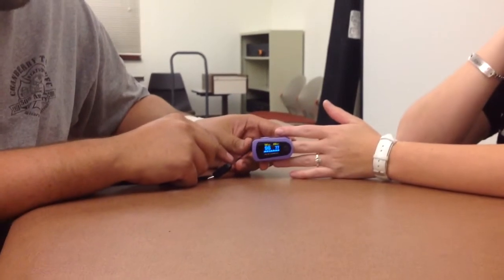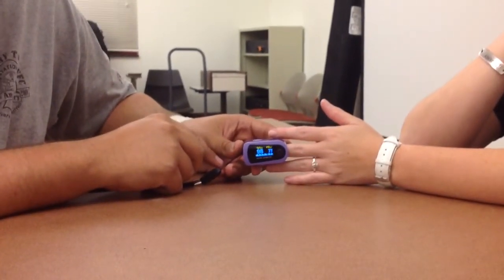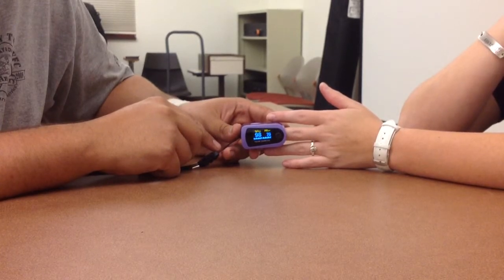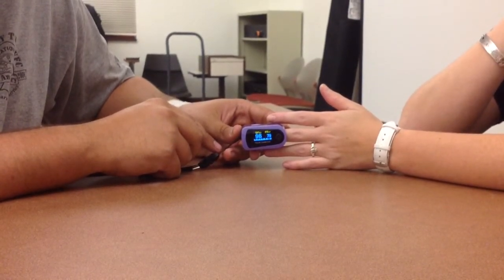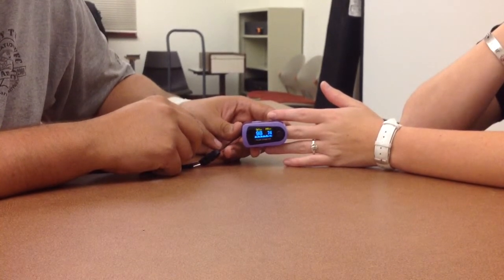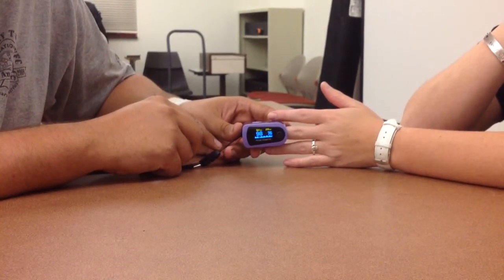The way a pulse oximeter works is by sending different colors of light into the tissue at the end of the finger and then measuring the amount of light that returns. The machine uses this information to determine the proportion of oxygen in the blood and displays the oxygen saturation percentage, also called the SpO2.